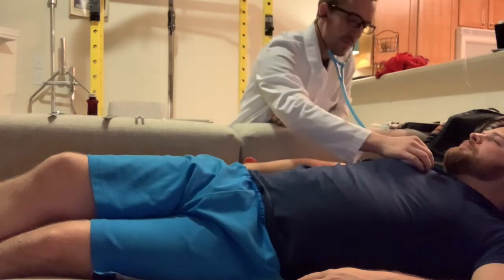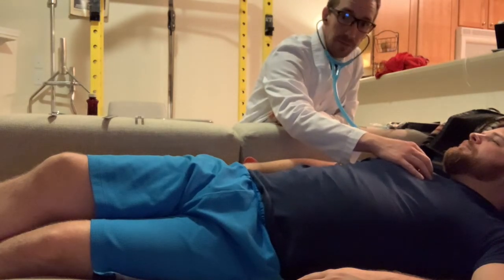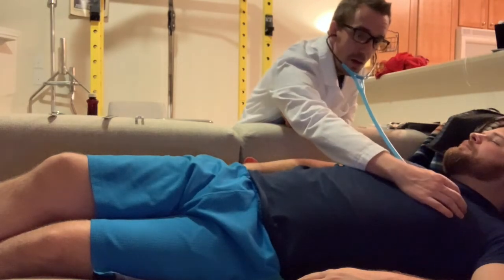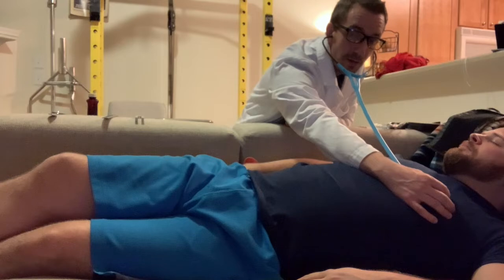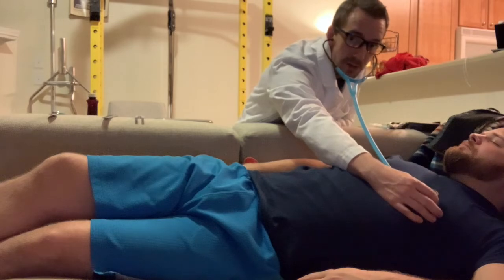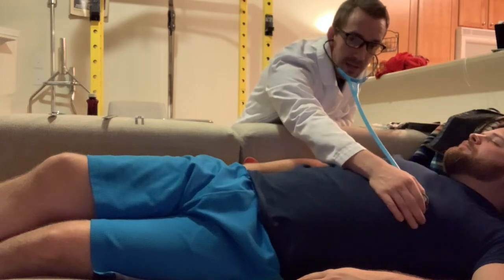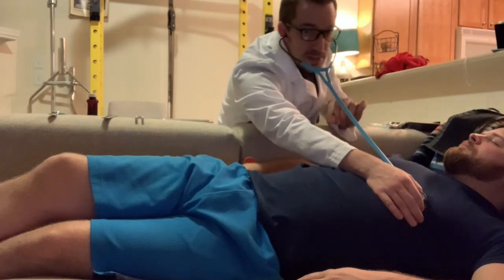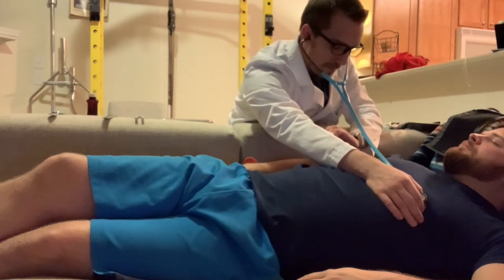So starting with the diaphragm, on the right second intercostal space, or the aortic area, and then moving to the pulmonic, the left second intercostal space, down to the Erb's point, the third intercostal space, the fourth intercostal space for the tricuspid valve, the fifth intercostal space, the mitral, and then here's a good place to listen for the apical heart rate. I'll listen for 1 minute, starting now.